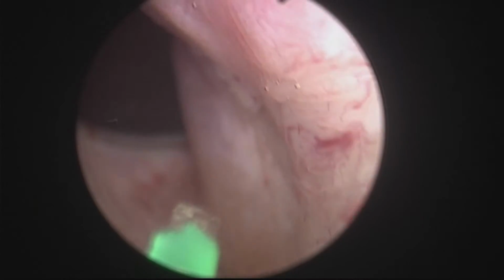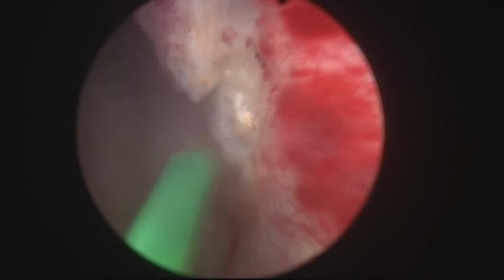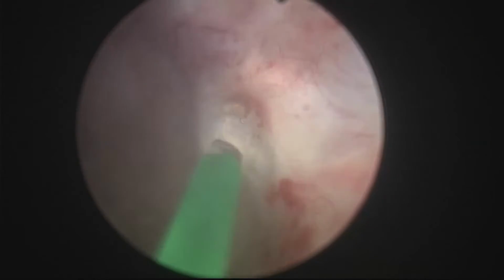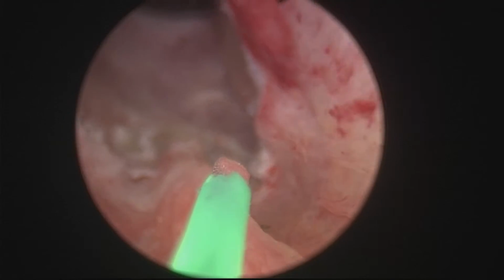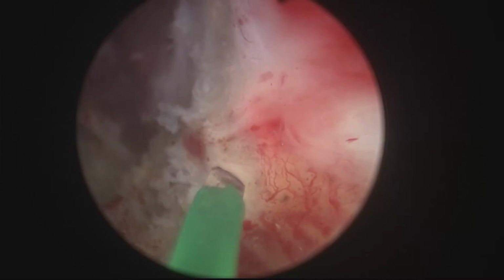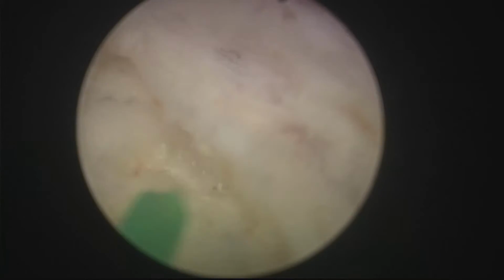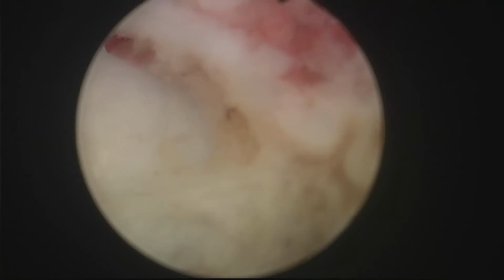And this is using Moses, and Moses is a pulse modulation emission mode, and the laser emits 2 pulses instead of 1. So this enhances the cutting properties and the coagulation properties. So here, you see, the thing here is you have to respect the sphincter, but you have to make sure that you remove everything. So here I'm just trying to find out what the white line should look like to try to do the most perfect possible job.